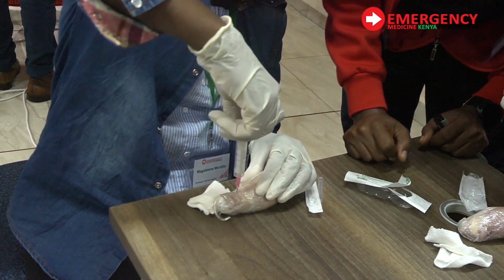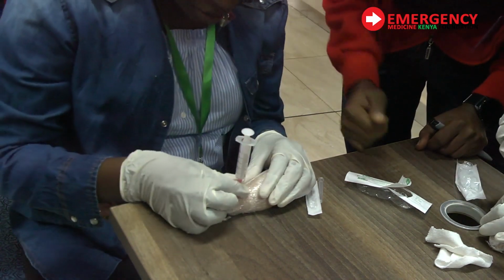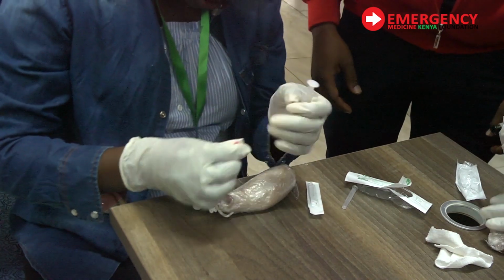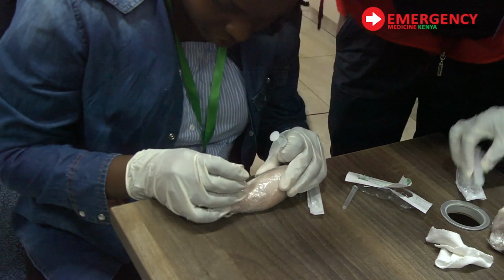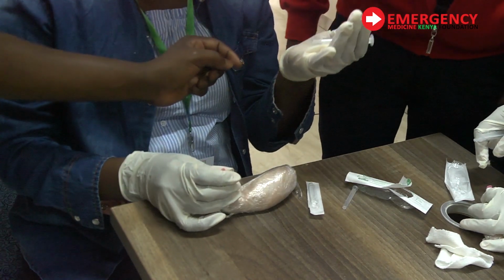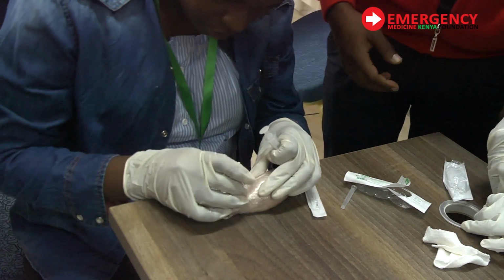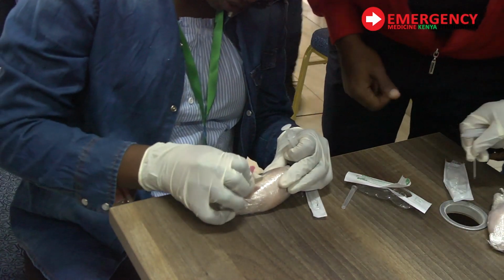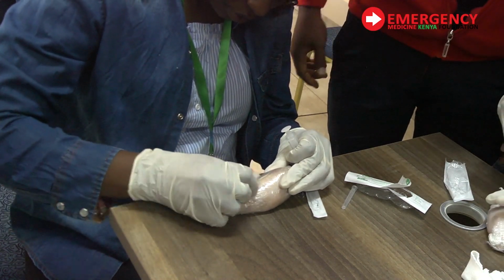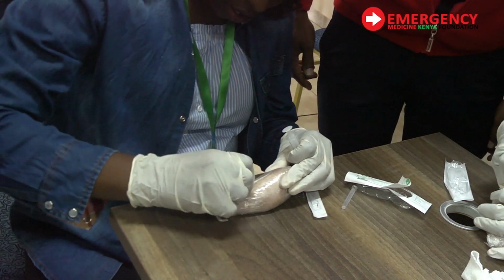Yeah, so you see what you're doing this way. When you do it this way, your needle will fold. So the trick is, use this part of the finger to hold the tip of the needle, then you pick your flat surface like here. So once you are there, you rotate. So you are using this to put pressure, and this is rotating. There is a pressure and then a give.